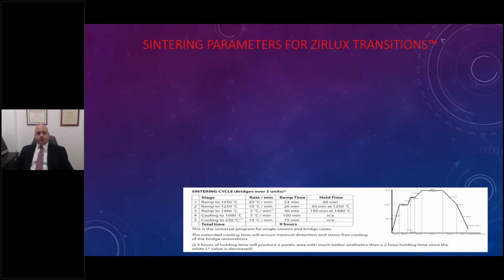So now, the sintering parameter is another benefit to this, and it's something that I really encourage you to at the very least try, and I think you too will be very pleasantly and remarkably pleased with the results. But looking at the production, when I say digital, it doesn't only mean hardware, it doesn't only mean scanners, it doesn't only mean mills, it also means, in my mind, material science, which is the materials that we're utilizing.